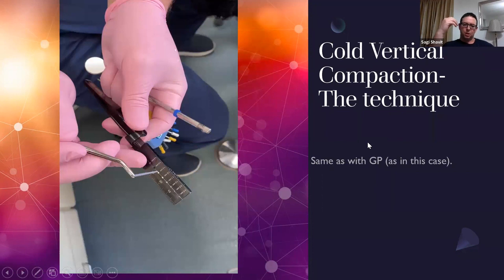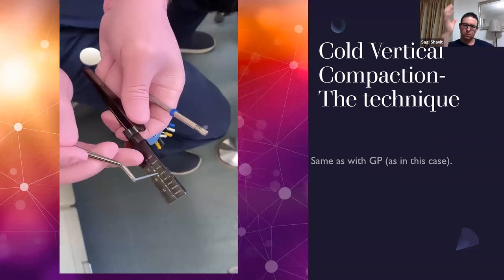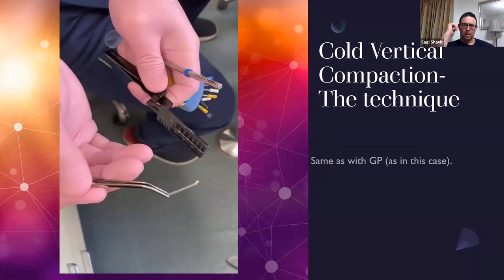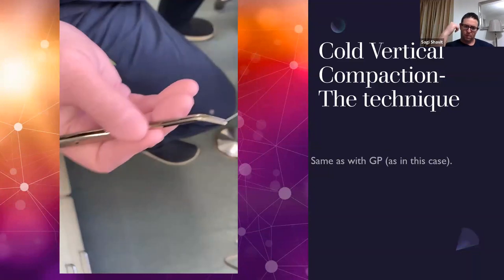If you are using a GP point, and I would recommend using those type of GP points, the colored ones, because they're more rigid. It's easier to push them and release the material from the pellet former. Just in this way, same thing. This is from the actual case, by the way. Okay, take it out, there you go. Okay, so you get about 2 to 3 millimeter of a pellet.